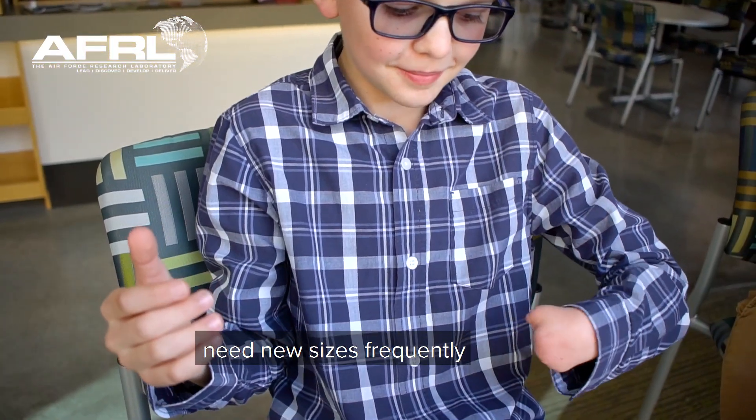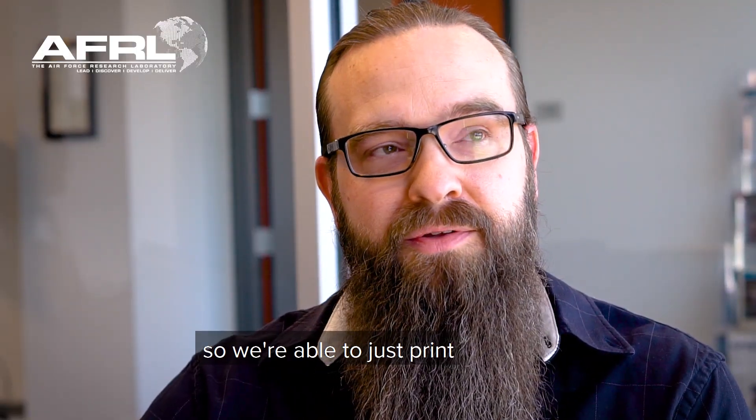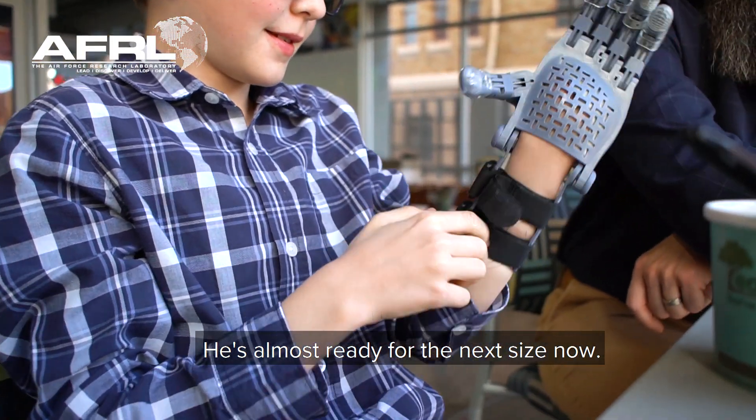As kids grow, they need new sizes frequently. So we're able to just print the next size up. He's almost ready for the next size now.